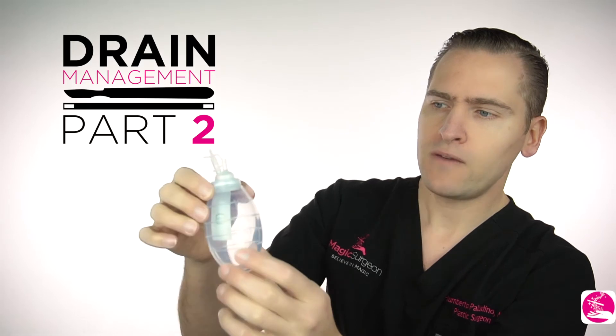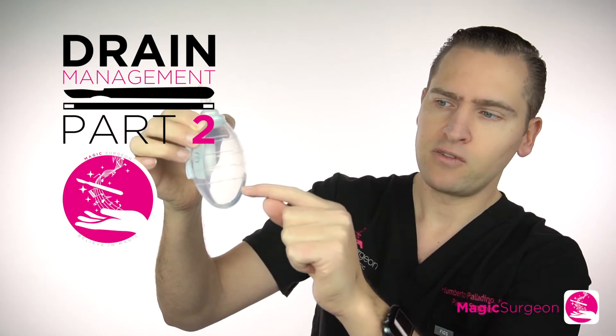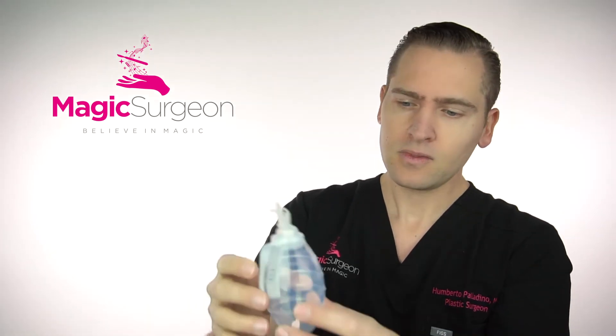Here are the gradings: 25, 50, 75, 100. So when you have your drain bulb open like this and your fluid is in between, for example around 25 or slightly above for the whole day, then you're ready to have the drain removed. You go back and call your plastic surgeon's office, and go back to your surgeon to have the drain removed, because you don't need it anymore.